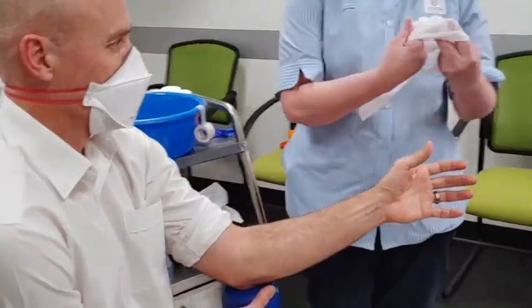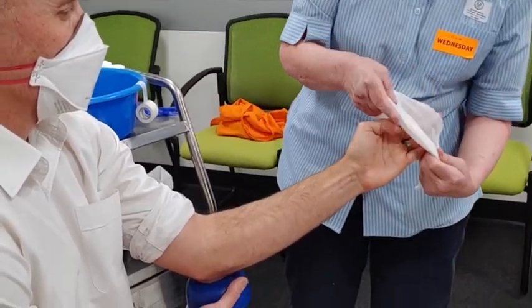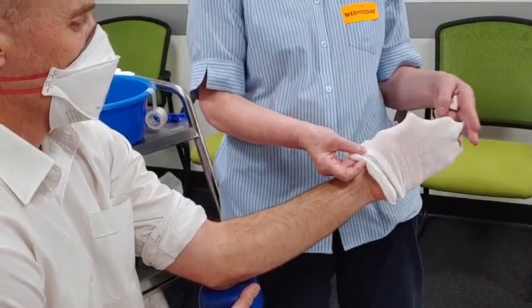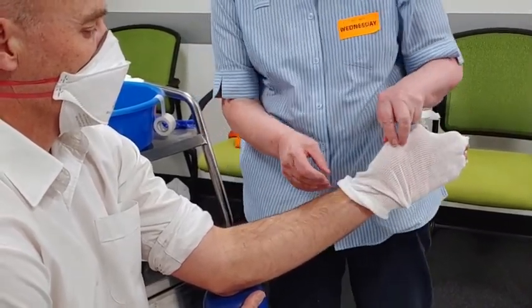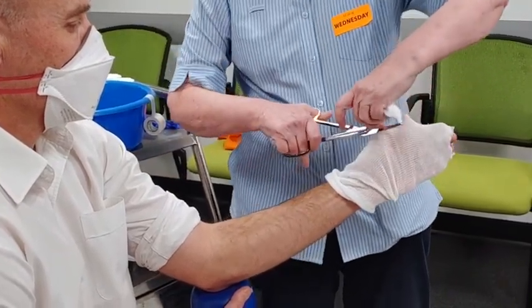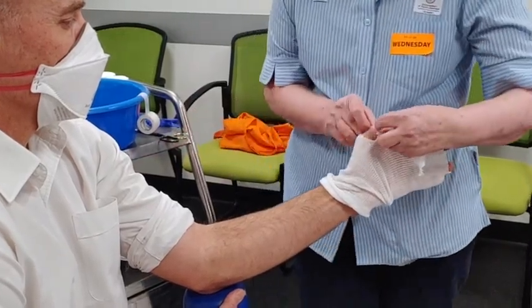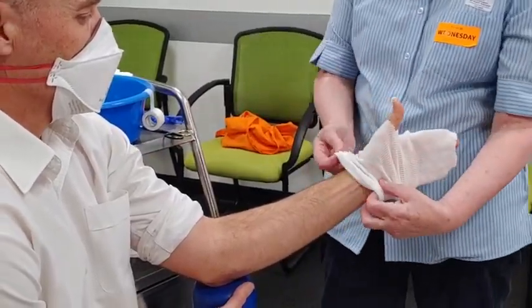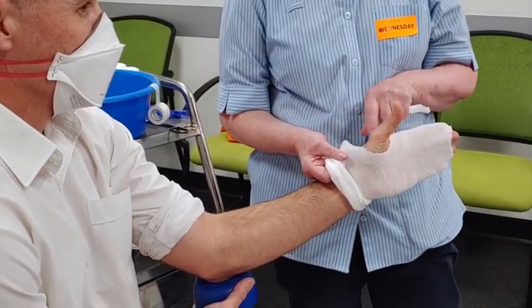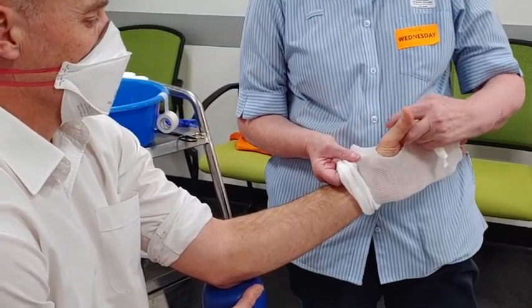With the stocking, roll it up and place it just over the fingertips — don't go too far down. Come down to the thumb, just a little twist and a hole. Don't pull too tight here because this can be quite sharp and can actually cut into the thumb space and be quite uncomfortable. Just make sure it's not too tight there.